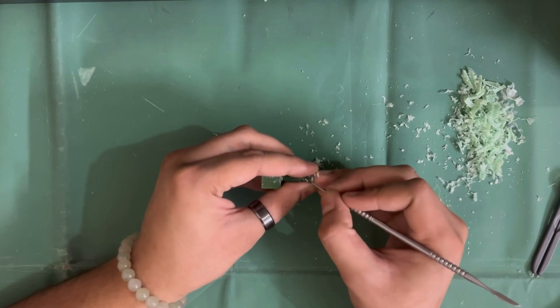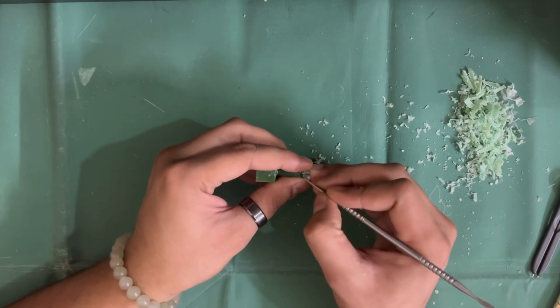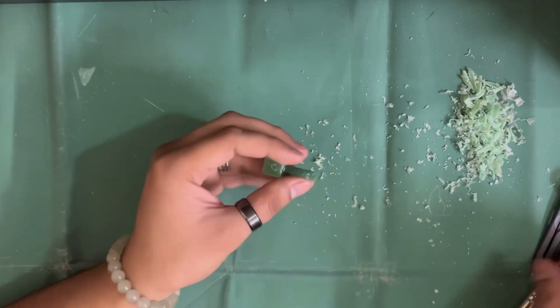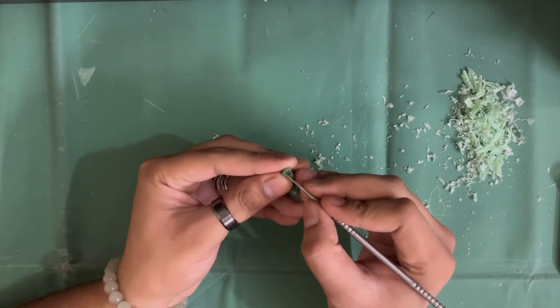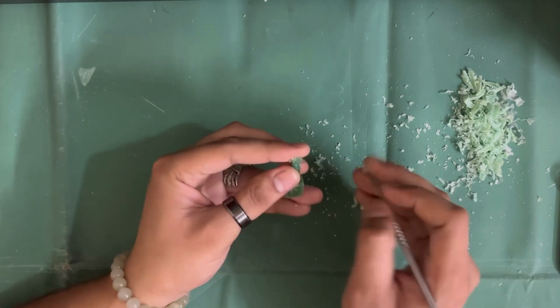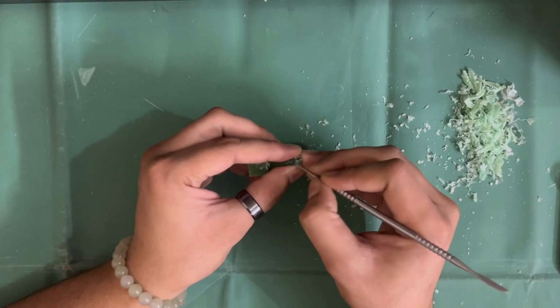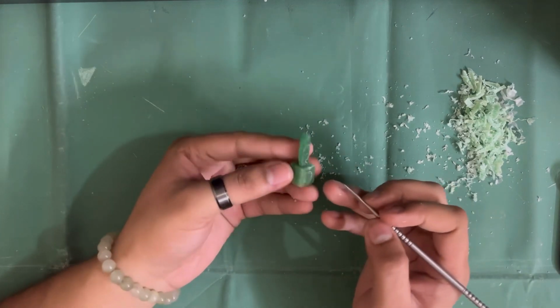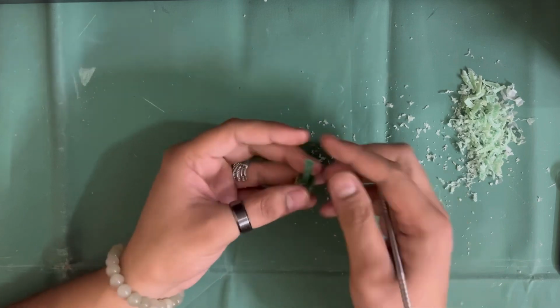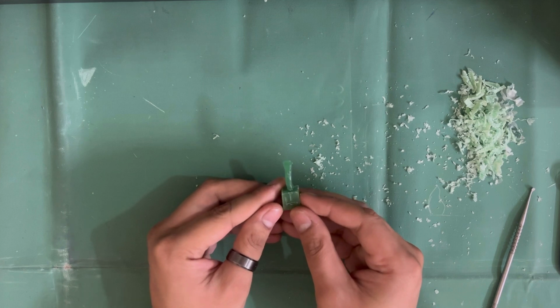After doing the crown length perfect, create the fossa, your cingulum, and give the sharpie edge to the incisal aspect. Finally, we have achieved the permanent mandibular central incisor.